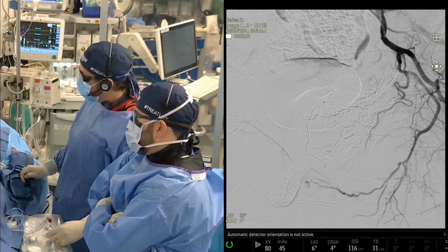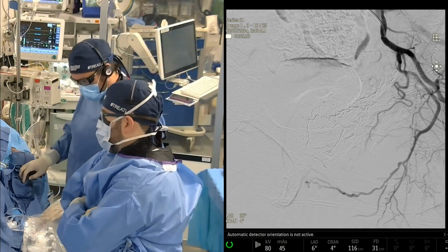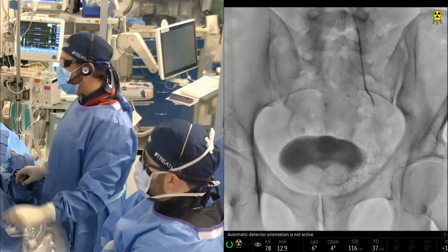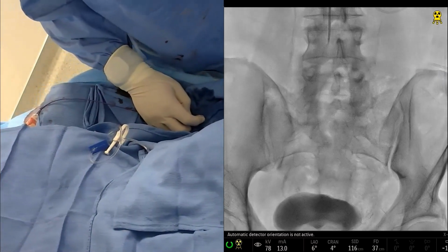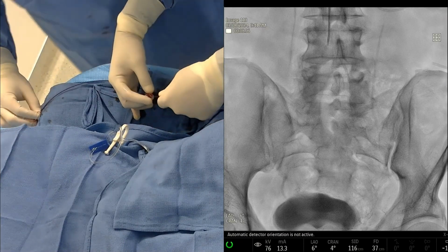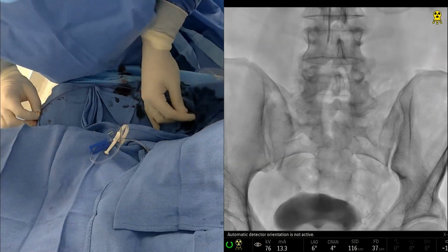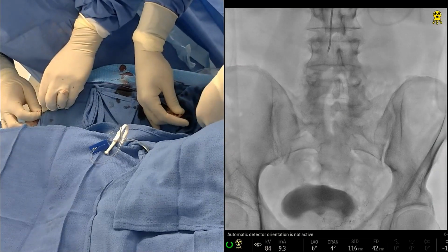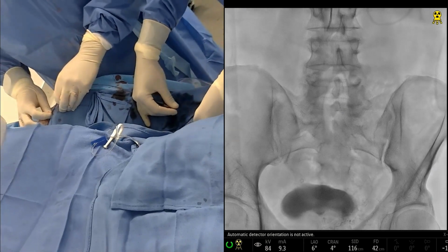And just to highlight the collateral that we saw and the control that we had, there's a conversation now where we're at a place with prostates where it's retreatment, recurrence. And one of the ways to prevent that is going into collateral vessels, coiling things off. None of that was necessary here. Again, there are a lot of operators, and sometimes with us, even if we were doing particles in the past, who would have gone there, seen the collateral, coiled it off, and then had to do the primary embolization. And, just another demonstration with glue about how it's a one-shot deal with the control that you have, and it's incredibly fast. There's a really nice example.